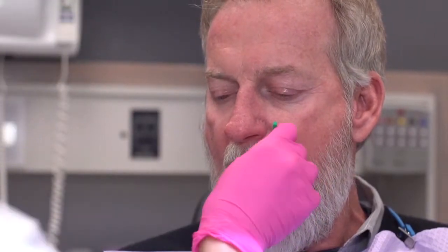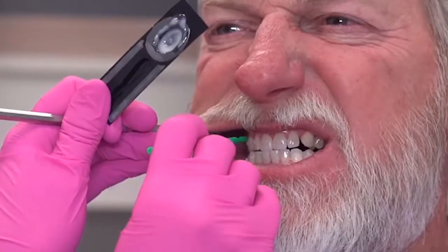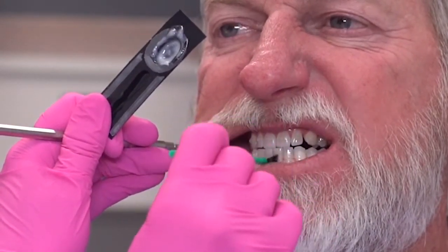Fill your applicator brush with fluoridose and swipe it along the lingual arch. Then ask your patient to look straight ahead, retract the left cheek, refill your applicator brush, and swipe across the maxillary arch on the left, then swipe across the mandibular arch on the left.